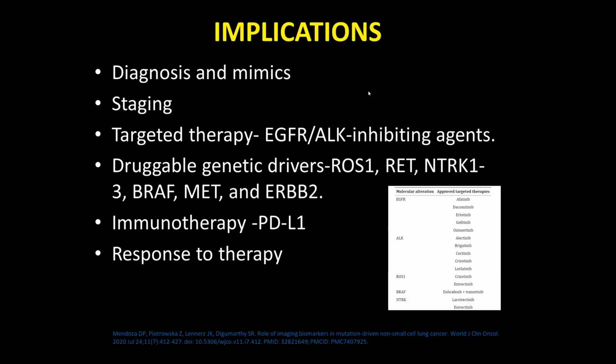Do not label everything. There is a tendency, as Aparna said, to call everything TB, or infection: any ground glass, okay, this is some infection sequela. No. We have to be able to recognize, tune our eyes, and at the back of the mind think, can this be lung cancer? In today's situation, I think that is very, very important, because we tend to overlook.